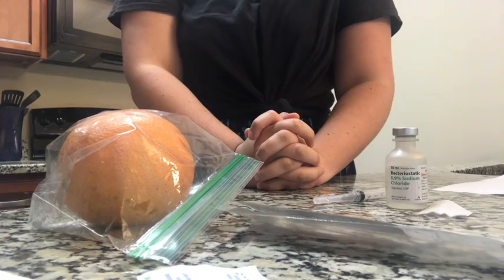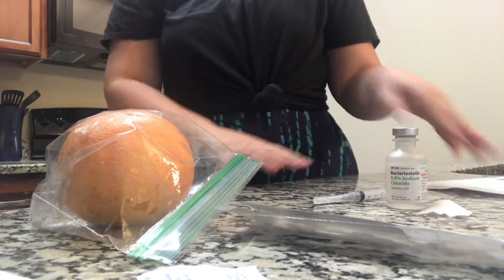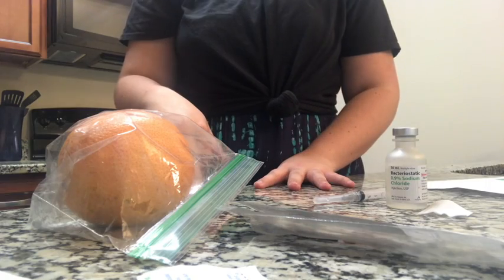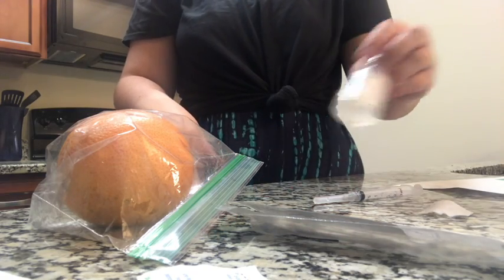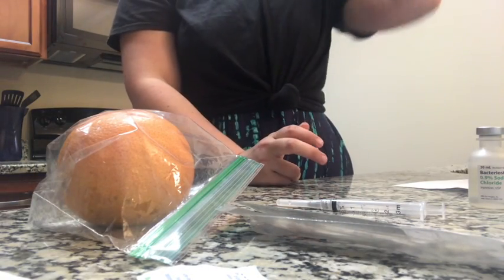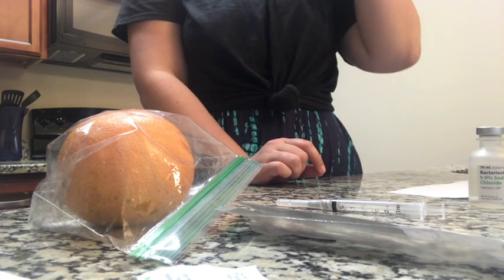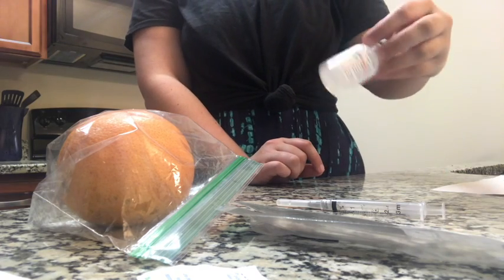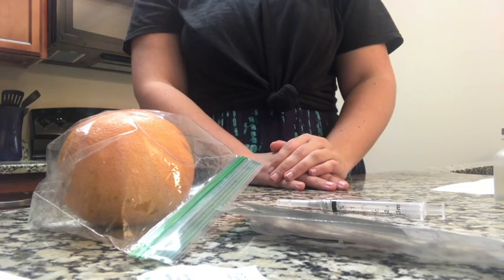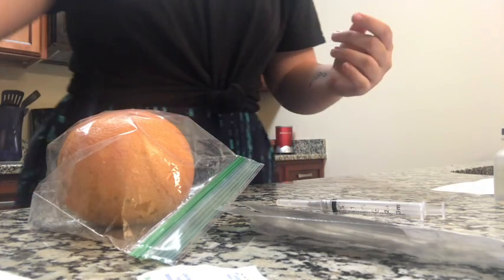So I have my MAR here. I have all of my equipment. I've checked the medication order. He has no allergies that we know of, so that is good. He is able to get this medication. And I have performed all the necessary calculations. We have 1 milligram per milliliter, so I just divided that and he will get 0.5 milliliters. So that is correct. Now I'm performing hand hygiene, and I will put on gloves.